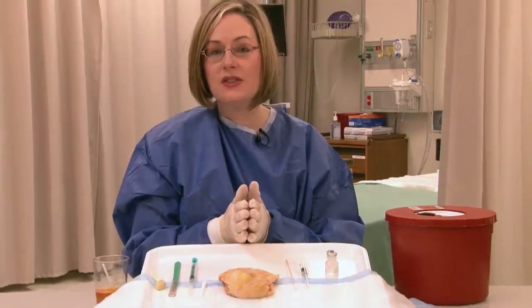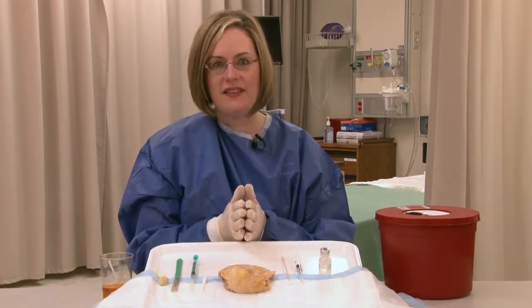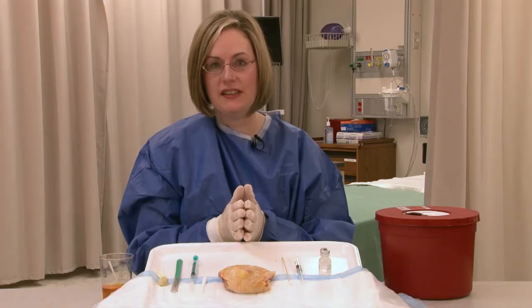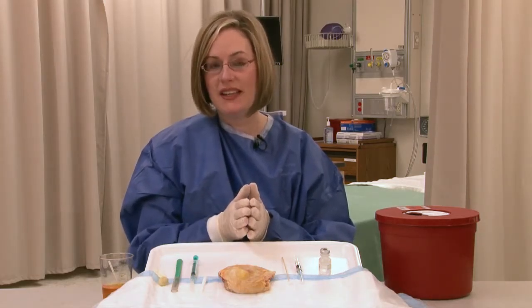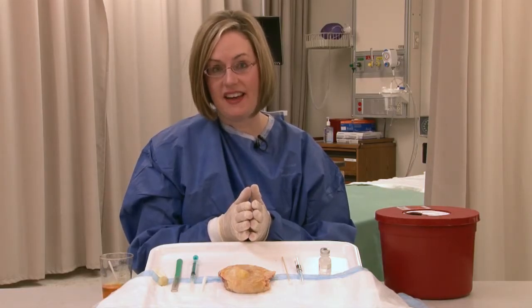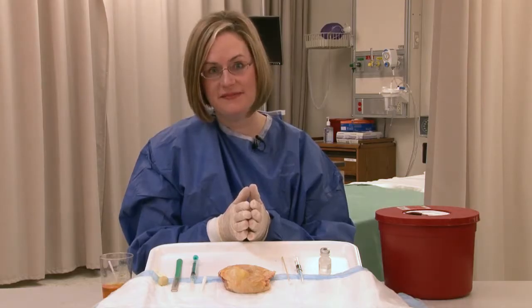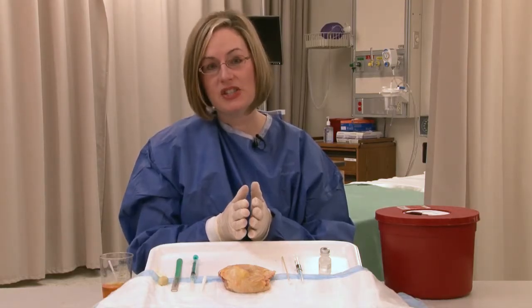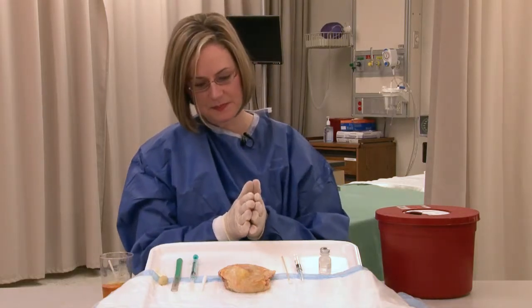All right, when performing this procedure, you should first review with the patient any risks and benefits associated with this procedure and obtain a signed informed consent. That should be placed on the chart. Then confirm any allergies that the patient has. Then place the patient in the lithotomy position. The practitioner should wash their hands and apply gloves.